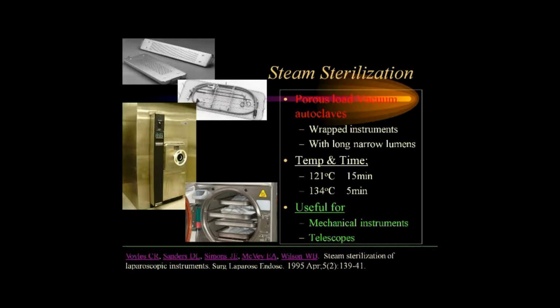Autoclaving is the benchmark for achieving sterilization of all the laparoscopic instruments, and the effectiveness of other sterilization methodologies will be compared only with the autoclave.